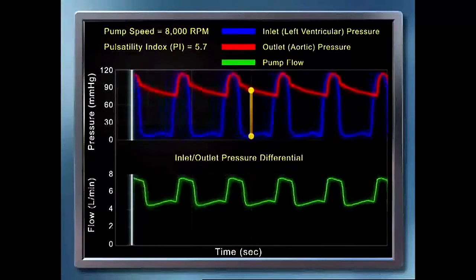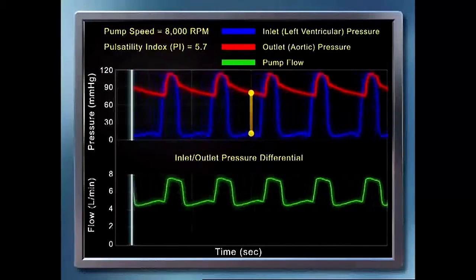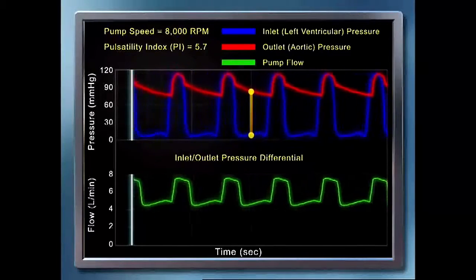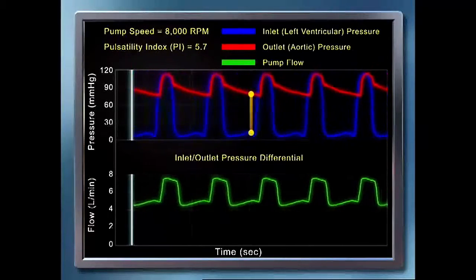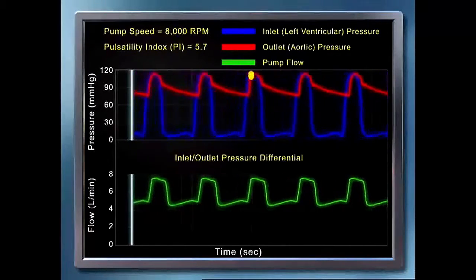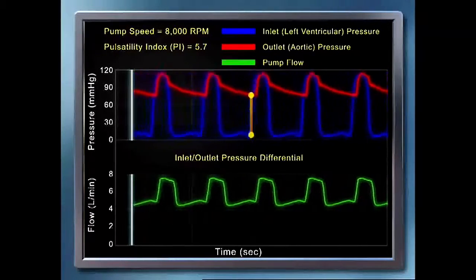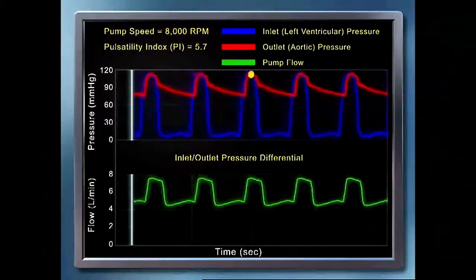In other words, for the example shown, during cardiac systole, the blue waveform, LV pressure, rises and is essentially identical to the red waveform, aortic pressure, which results in a decrease in the differential pressure. This is shown by the yellow bar becoming shorter. As the pump inlet and outlet pressures become more equalized, it becomes easier for the pump to propel blood forward, and therefore pump flow increases. This is shown by the increase in flow on the green waveform.